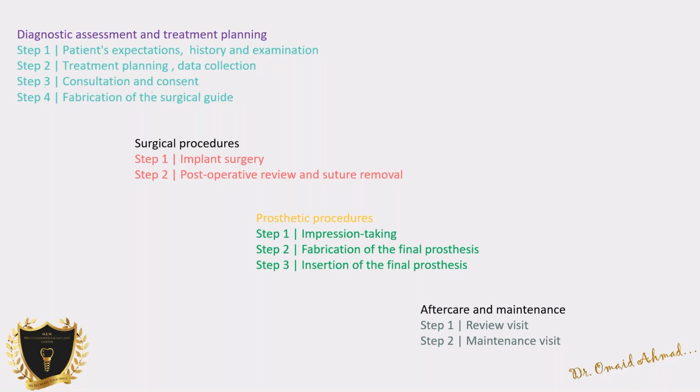Number one step, diagnostic assessment and treatment planning. Step one, you see the patient, discuss expectations, history, examination. Step two, your treatment plan, collect the data: IOS scan, CBCT, VPS impression, whatever you're doing. Then you come to a consultation with the patient and have a consent signed. If you are doing the surgery, you will do it all yourself. If you're sending it to a provider, they will take care of it. You fabricate a surgical guide.